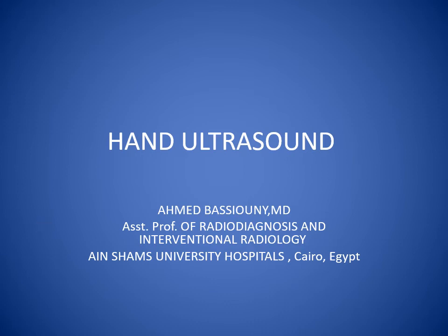Today's lecture will be about the hand ultrasound. We are going to talk also about the technique and the common pathologies.